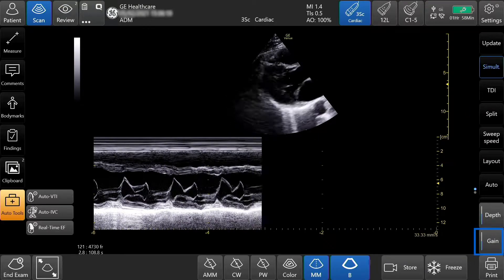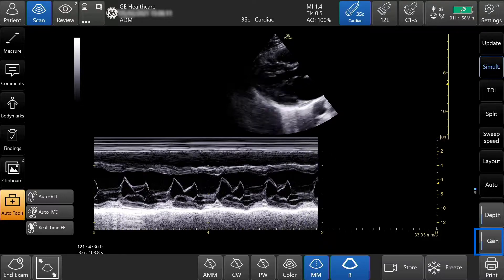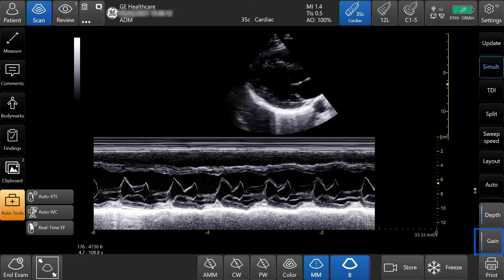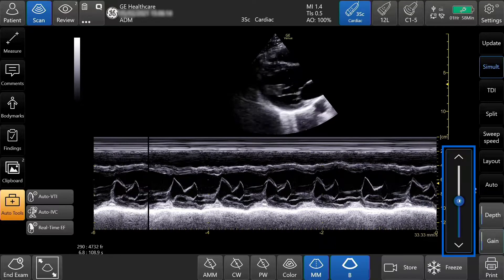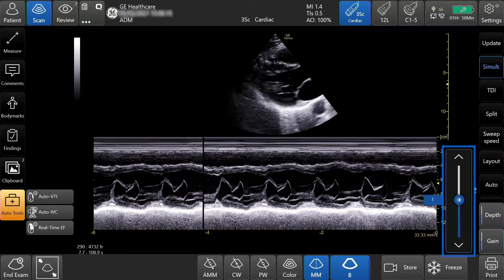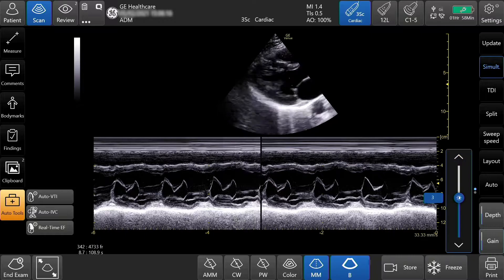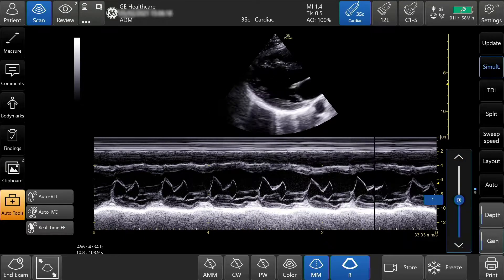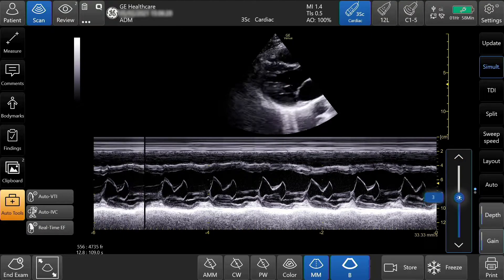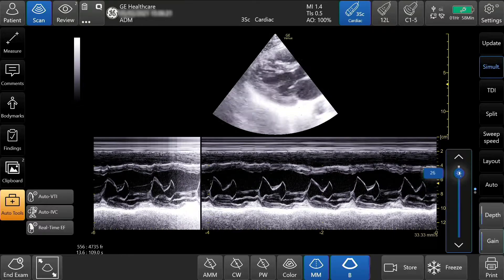Use the gain button to increase or decrease the M mode brightness by pressing the arrows up or down, or by moving the slide bar.